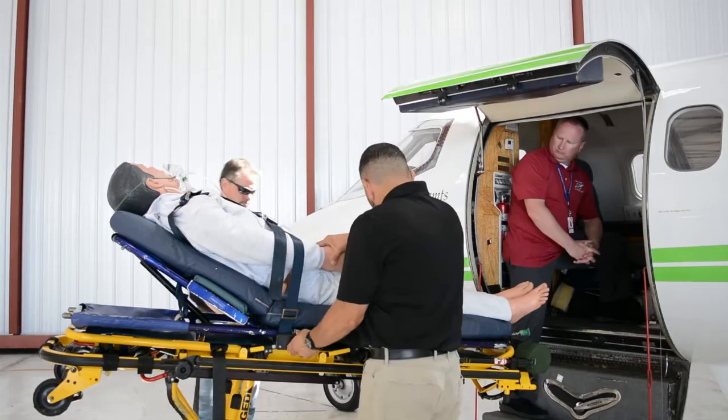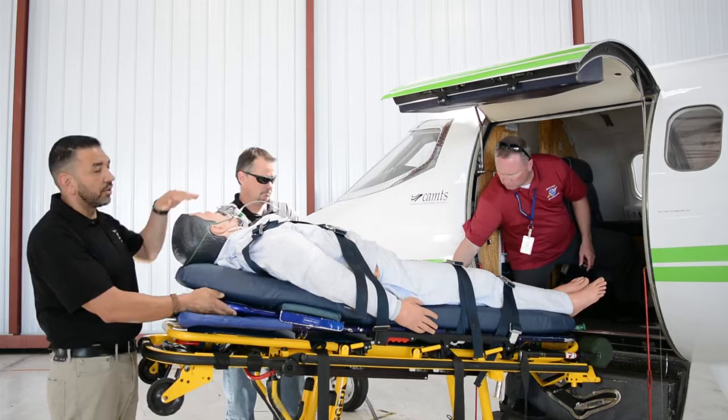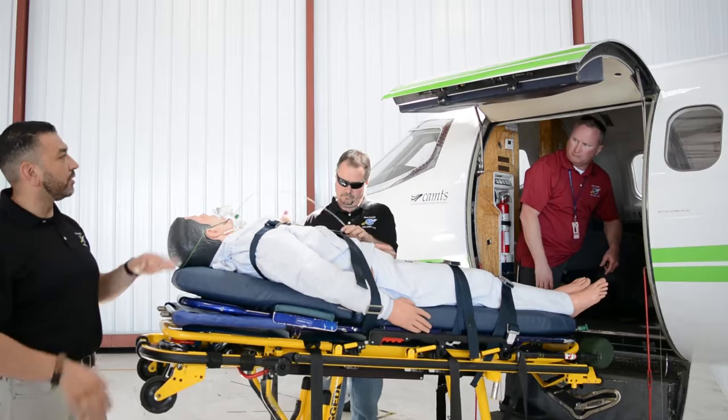And I'm also going to, we want to make sure that we can bring the patient as flat as possible without causing discomfort, because we want to make sure that we're clearing the upper part of the doorway. A patient sitting upright is not going to clear that door, and we have the chance of them hitting their head.